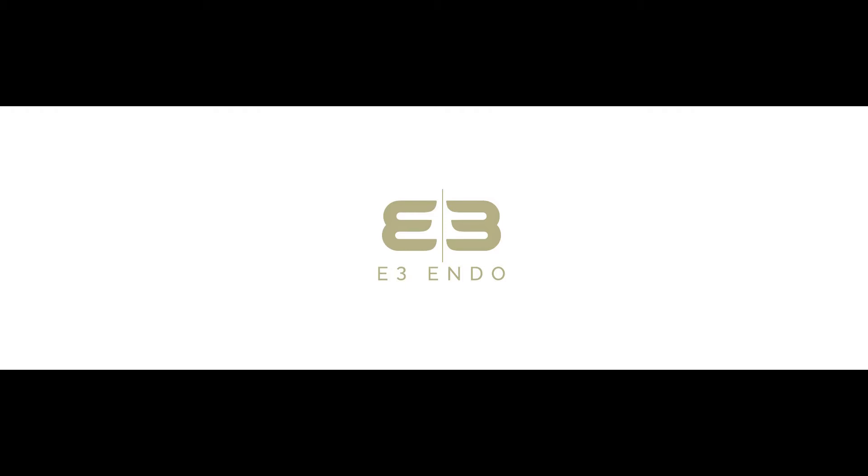We just made this short video on obturation of the DC taper preparations. As you've been using the DC taper files, excellent file, really does a nice job, but being quite conservative does require certain GP cones to obturate it effectively.